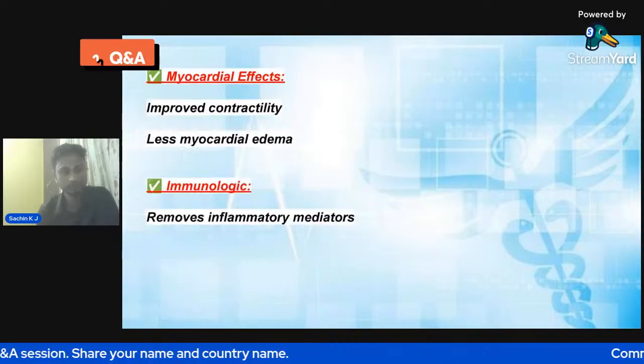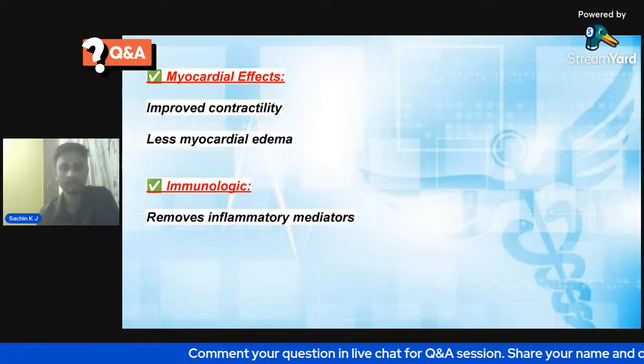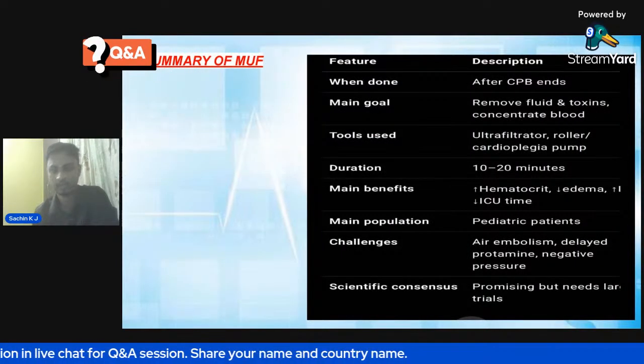So next one, sir. Myocardial effect: it improves myocardial contractility and reduces myocardial edema. Immunological: it removes inflammatory mediators. So next one, sir. And summary of MUF.